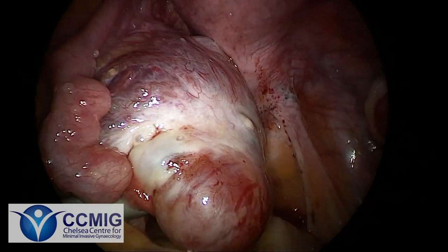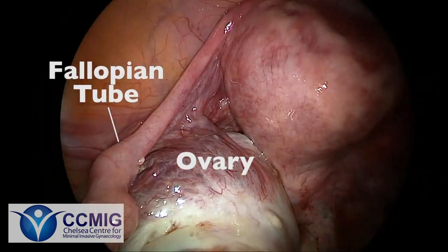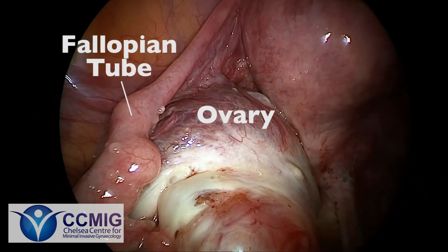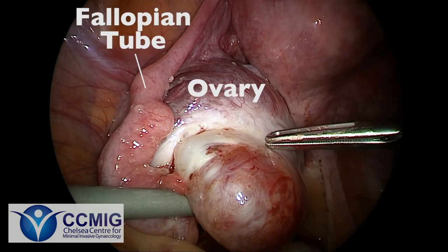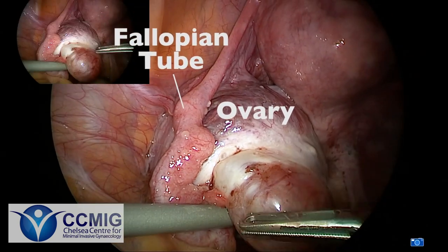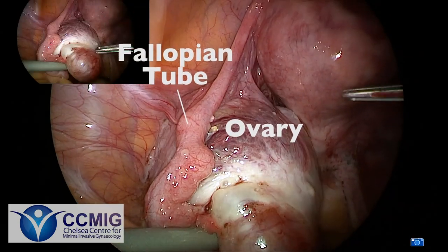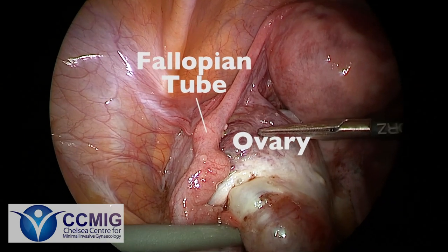Now we move on to the elephant in the room — this very large swollen left ovary. We can see here this red cyst on the surface is probably a normal corpus luteum, which is associated with ovulation.